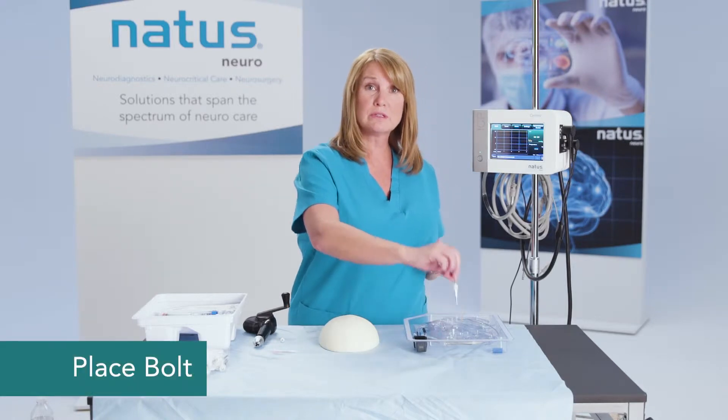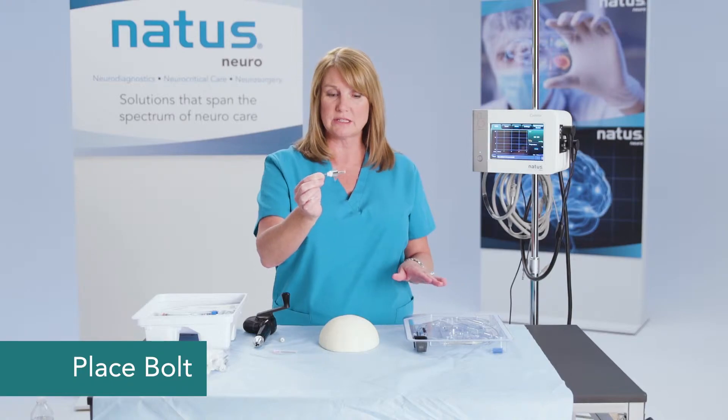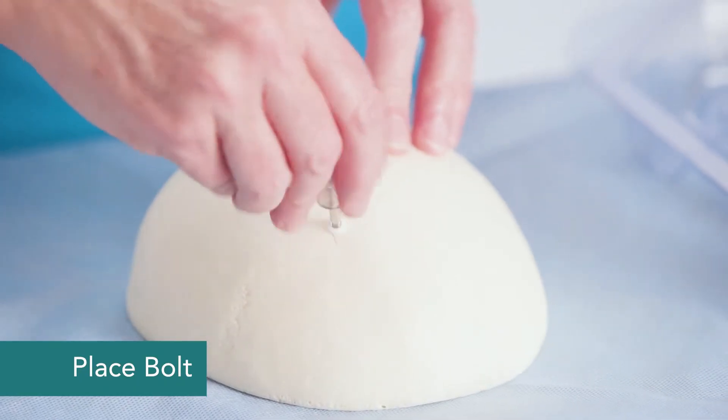Then you'll want to place your bolt. You'll pick the bolting system up exactly as it is in your kit and screw that into the skull itself.